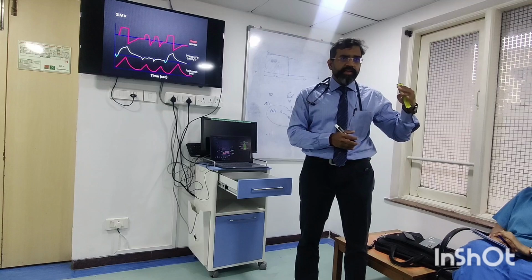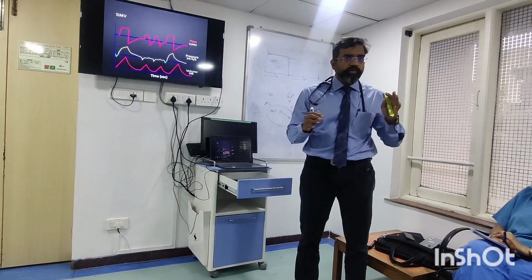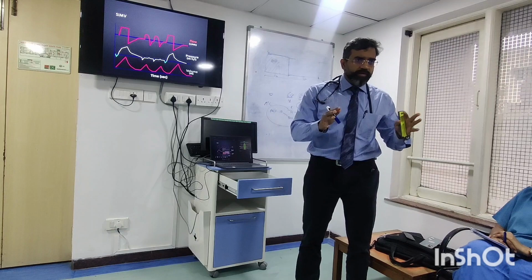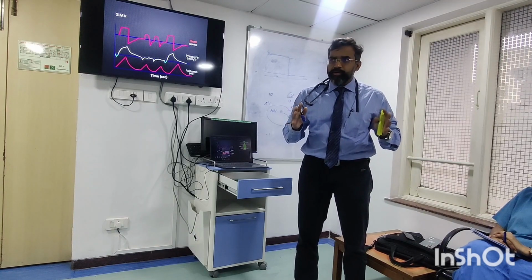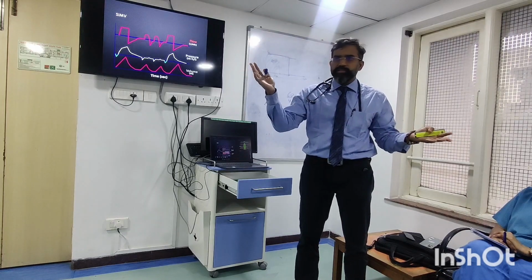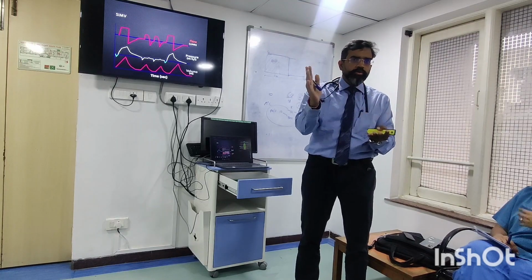Then the second thing that came in, initially, when you have controlled mechanical ventilation, has anyone worked with Manley ventilators? Okay, so you all wouldn't have worked with them. We worked with Manley ventilators. A Manley ventilator is like an ambu bag. What happens with the Manley ventilator is that it just gives a breath and nothing else, like an ambu bag, with a kind of bellows.